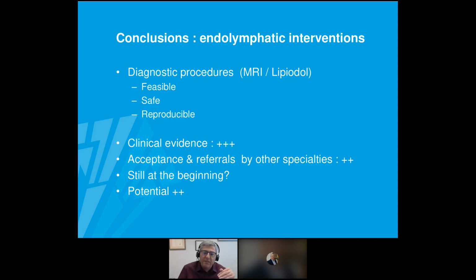So the better target is the largest lymphatic vessels. And where are the largest lymphatic vessels which are reachable by direct puncture under ultrasound guidance? Well, this is in the proximal right portal vein. That means that the proximal right portal vein is your first target for the puncture.